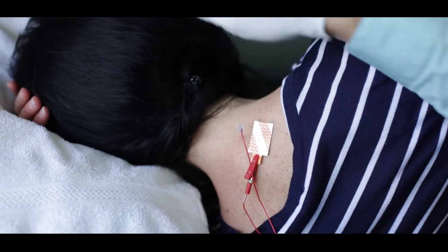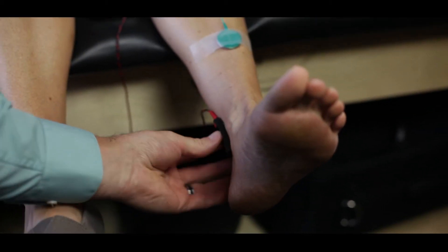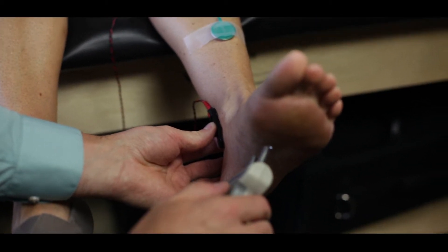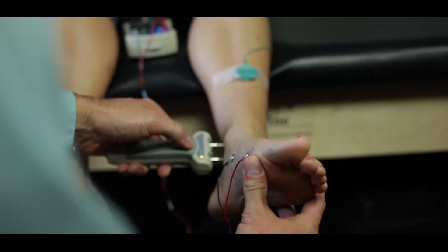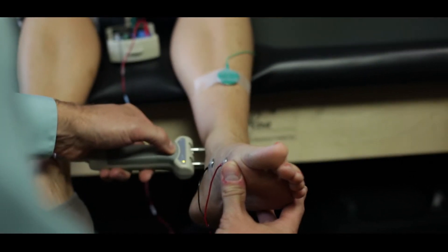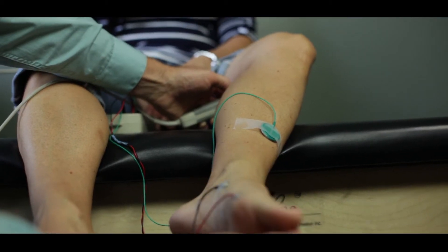Electrodiagnostic testing has the ability to measure nerve function in real time. I'm going to place this along the inside of your foot and stimulate right along the bottom here. Different from an x-ray or an MRI, we can see actual physiologic nerve responses, as opposed to just structural changes that you may find in imaging.